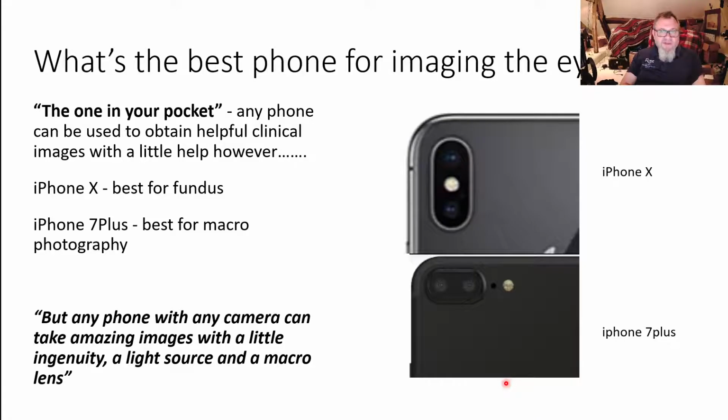So what's the best phone for imaging the eye? The one you've got with you. Any phone you have will help you to take clinical images. If your light is further away from your lens than on these iPhones, then if you get further away and zoom in with digital zoom, you should be able to get similar images.